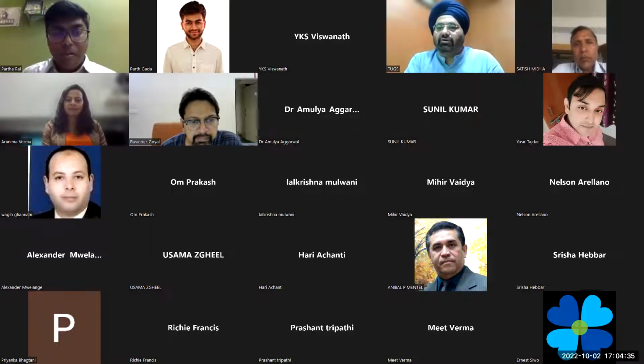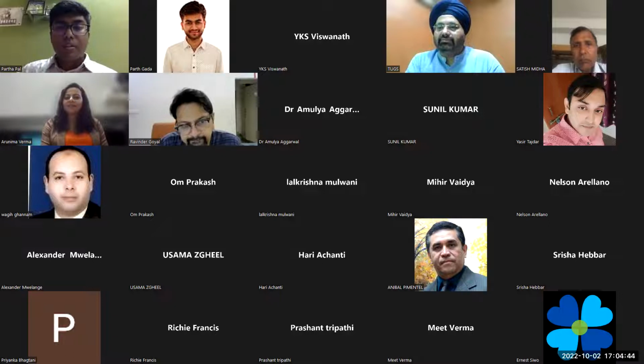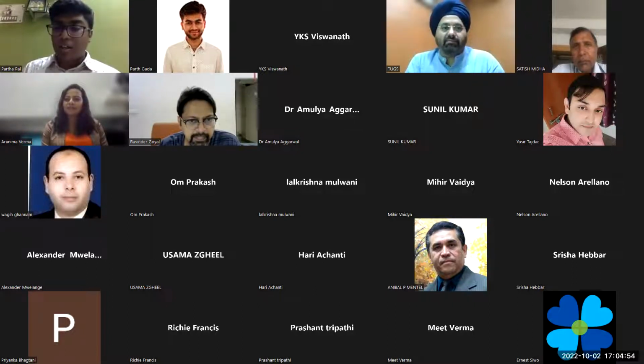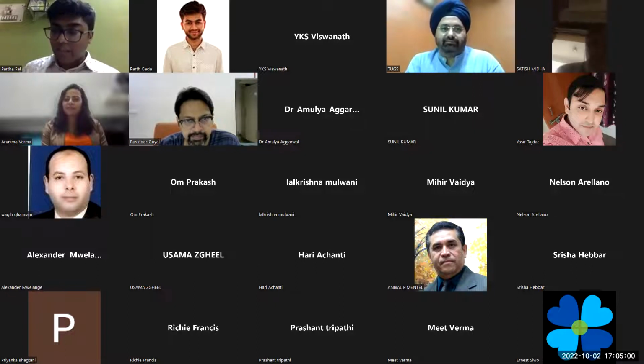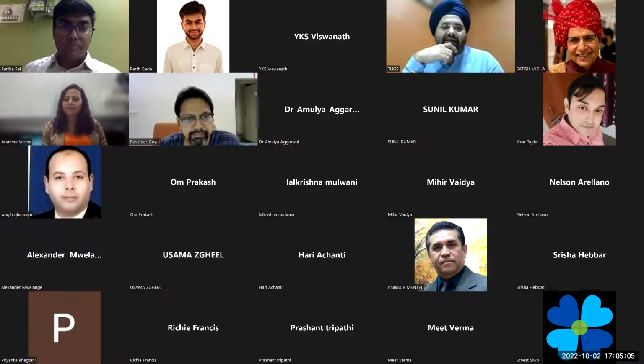The question from Dr. Prakash Valse is, will balloon dilatation help in gastroparesis which is not responding to medicines? Any comments on balloon dilatation in gastroparesis? It depends on the mechanism of gastroparesis, because some patients may have a functional obstruction of the gastric outlet. Those patients will benefit from balloon dilatation, not all patients, as the mechanism of gastroparesis may be different.